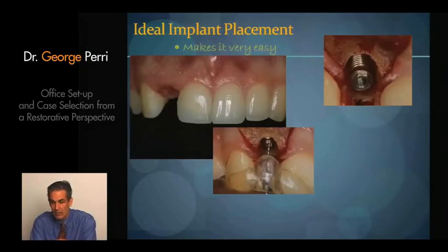We also notice how carefully Dr. Jovanovic placed the implant to the adjacent teeth. If the implant gets closer than 1.5, maybe as small as 1 millimeter, but certainly 1.5 to 2 would be ideal. As the implant gets closer, we're reducing the biologic potential of that bone and perhaps leading to bone loss from ischemia, lack of circulation, or actual bone loss from the implant placement. So a larger implant isn't an advantage on this case.